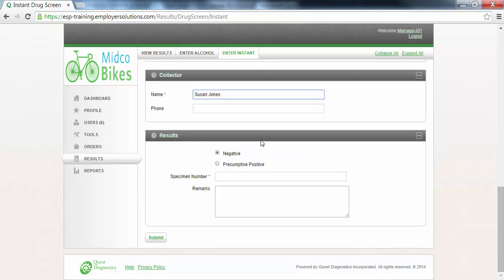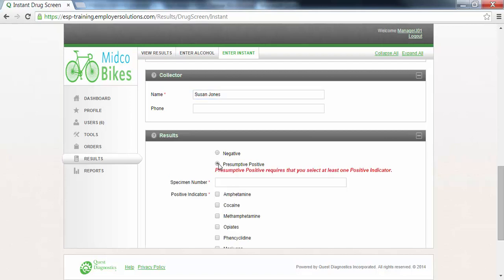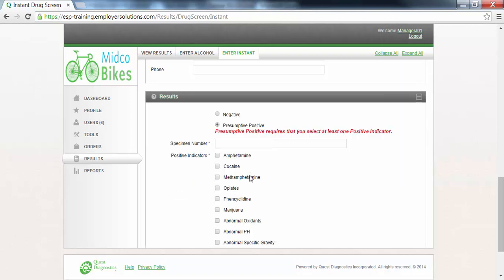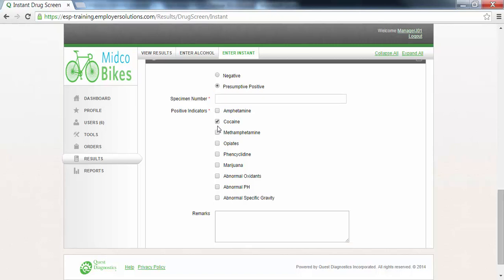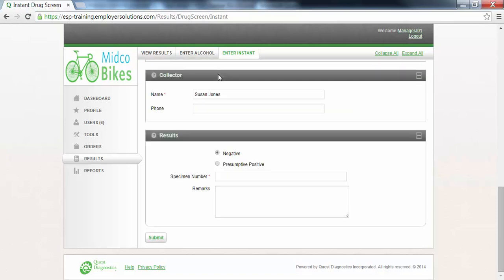The results section is where you will enter the instant test results. The negative radio button is selected by default but can be changed. If the result of the instant test was presumptive positive when this radio button is selected the drugs included in the test device will be presented on the page. Select the check box next to the drug or drugs that were indicated as presumptive positive on the device. Select the check box next to the specimen validity test results that were indicated as abnormal on the device where applicable. In this example we will leave the negative radio button selected.